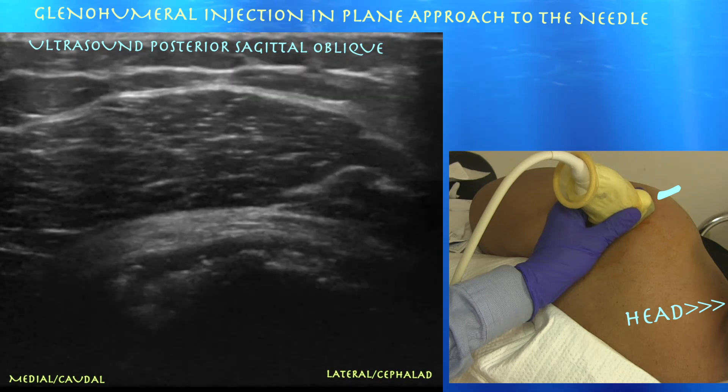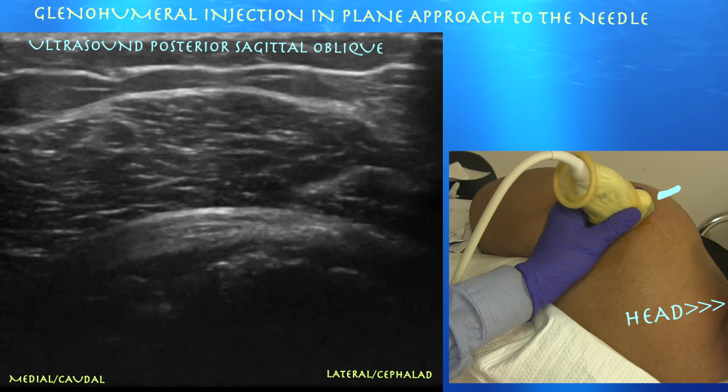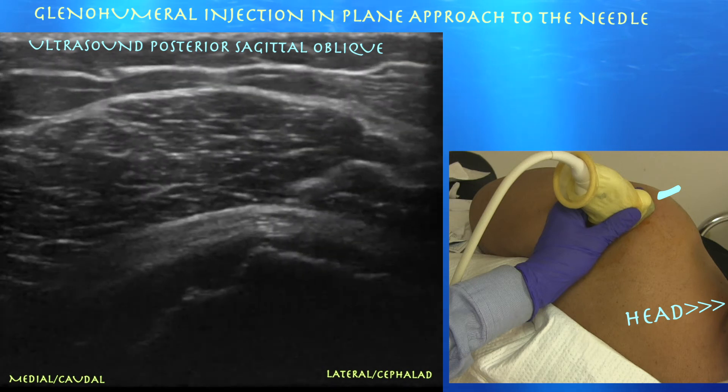Essentially what we're trying to do is get the needle underneath that infraspinatus tendon, more medial to where it attaches on the greater tuberosity. And here again we can see the needle on the right side of the screen going underneath that infraspinatus tendon.